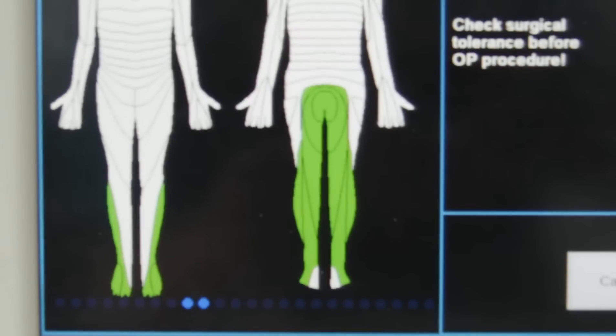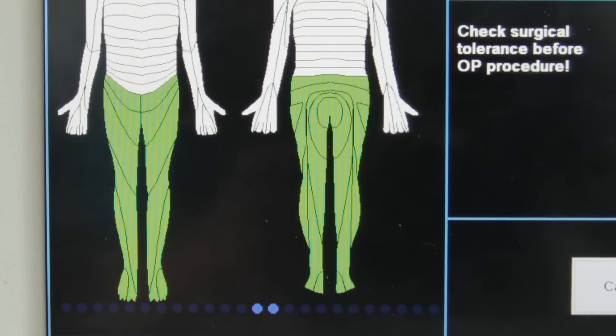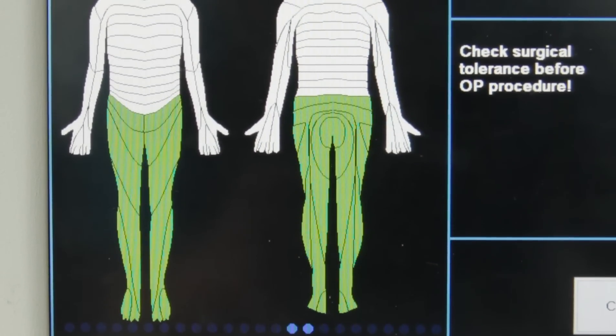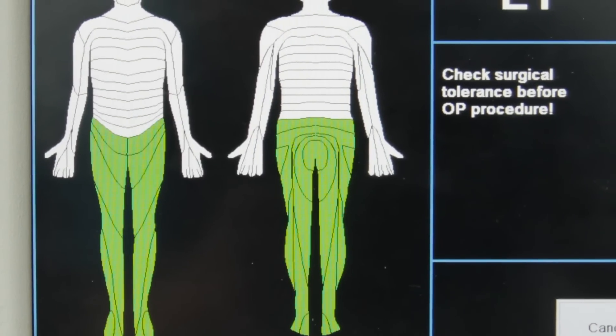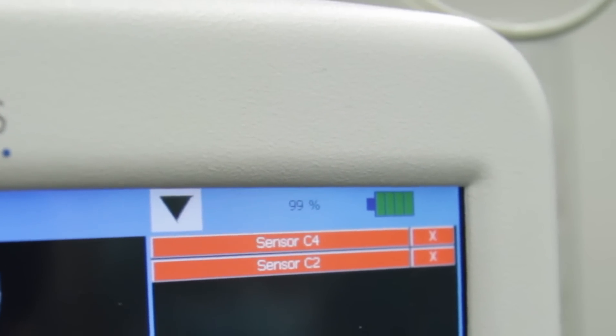After that we don't have to bother about anything anymore. The software runs automatically and visualizes the degree of the anesthesia. It is self-evident that the device has a status signal which signalizes any failure of the sensors.